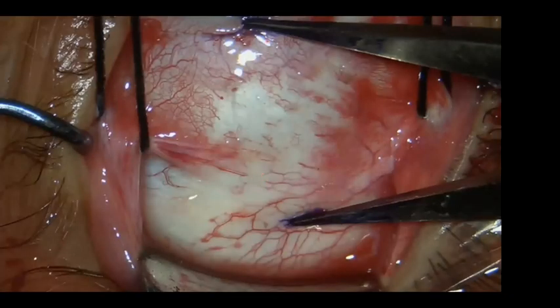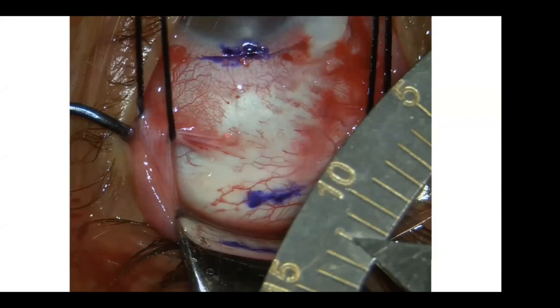And then I do measurements. I like to have the whole area clear like that. And it is centered between the lateral rectus and superior rectus here, and then from this distance, I go for 12 millimeter. What's written in the books, and what I used to do, is to put the implant at 8 to 10 millimeter, so that the implant is usually visible. Nowadays, I switched my technique to move the implant posterior, and I'm so happy with that step.